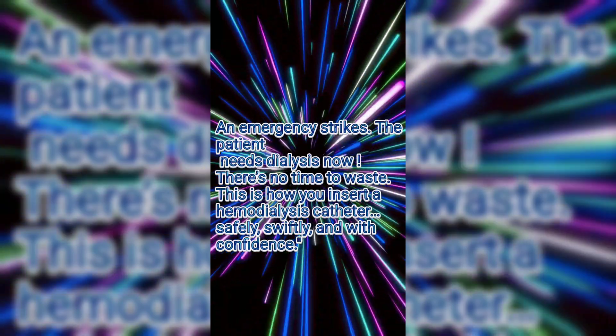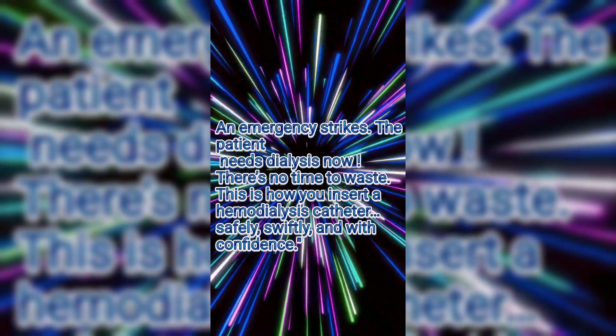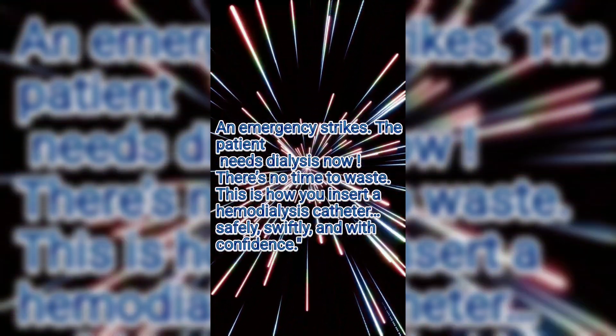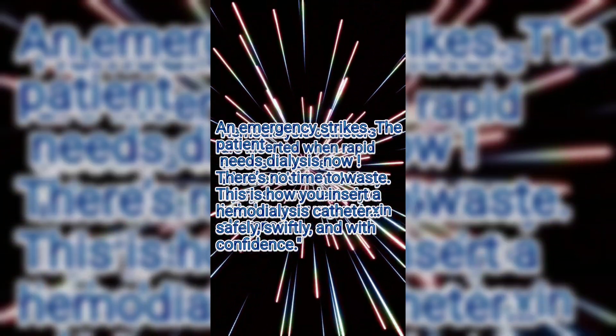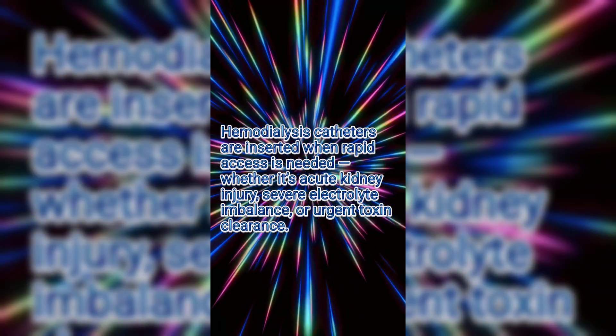When an emergency strikes and the patient needs dialysis now, there's no time to waste. This is how you insert a hemodialysis catheter — safely, swiftly, and with confidence. Hemodialysis catheters are inserted when rapid access is needed, whether it's acute kidney injury, severe electrolyte imbalance, or urgent toxin clearance.